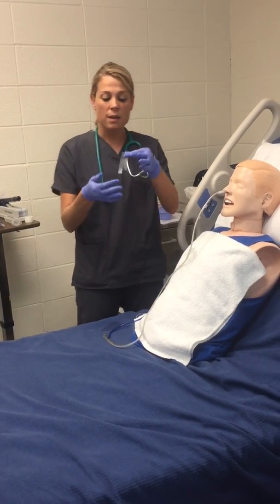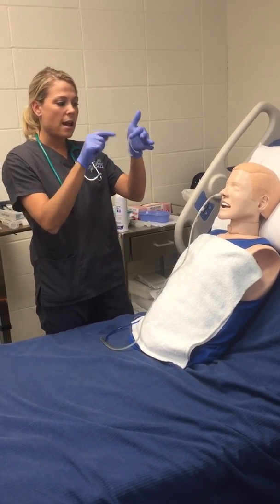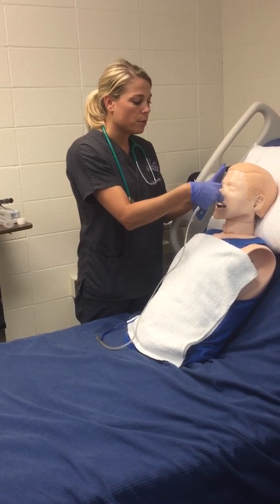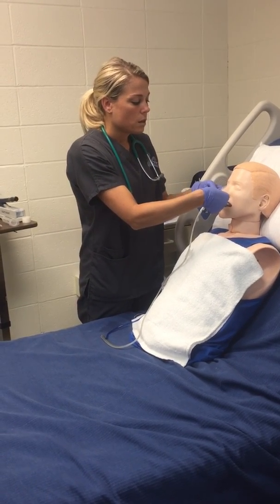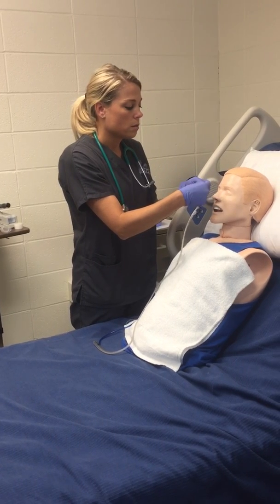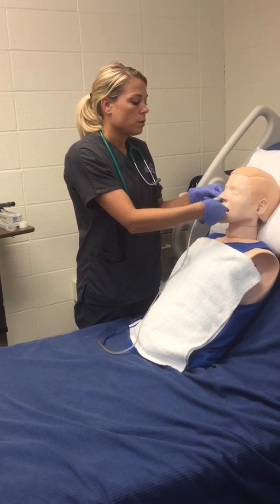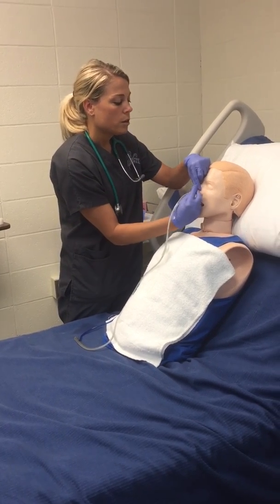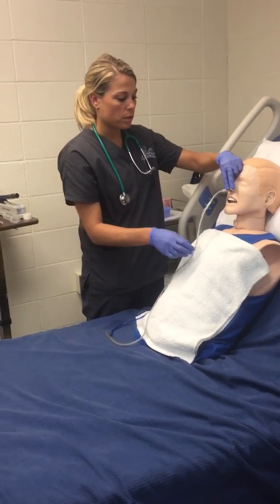I'm going to take a piece of tape and tear it in half, but not all the way, and make it look like a pair of pants. And put that on the bridge of the nose. And then we're just going to wrap that around. Under one, and then under the other one, and then make sure it's nice and properly secured.